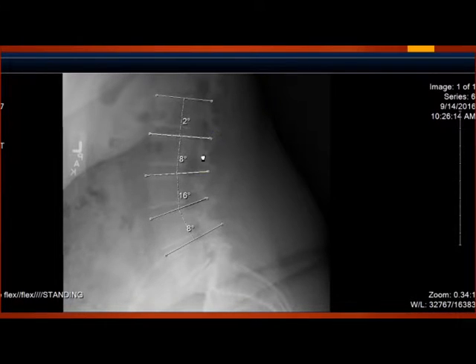So notice that nowhere in the lumbar spine do any of the lumbar spine vertebrae flex. Now you may see some flexion angles in your examinee. The reason that this examinee is not able to achieve a positive flexion angle is because of limitation to range of motion.